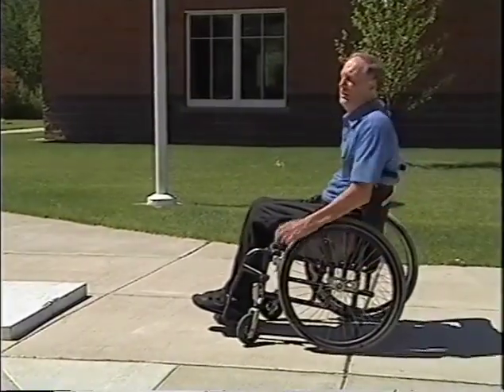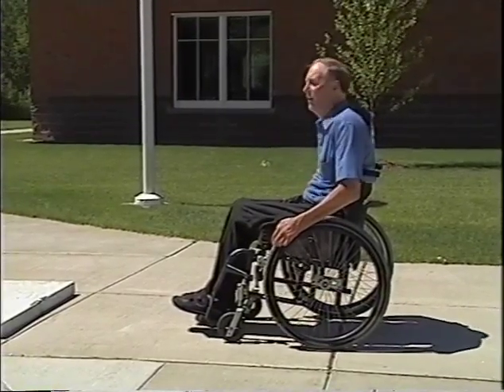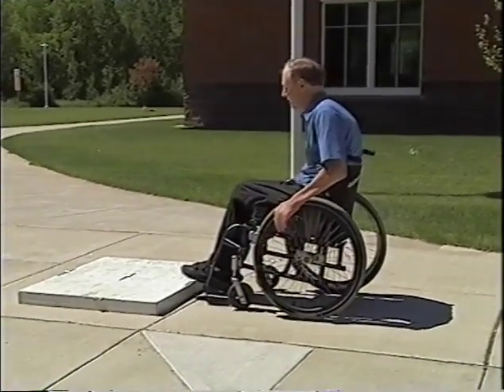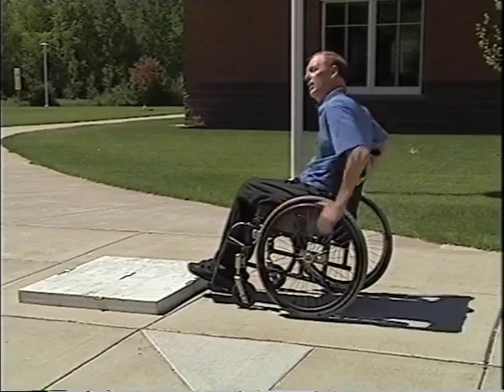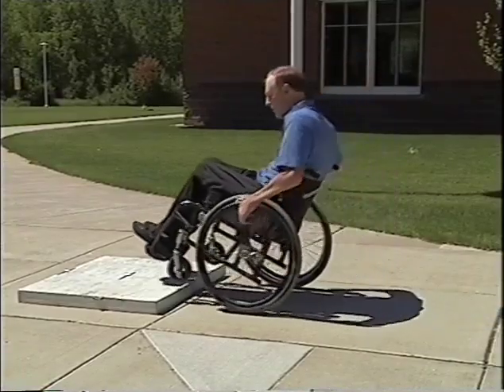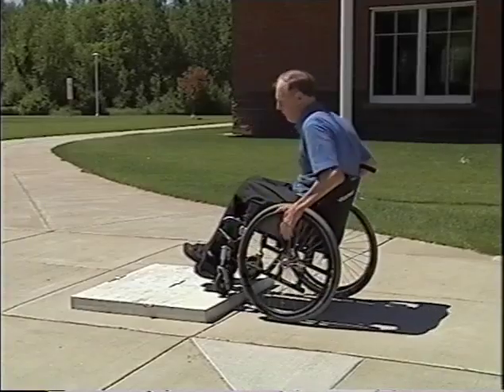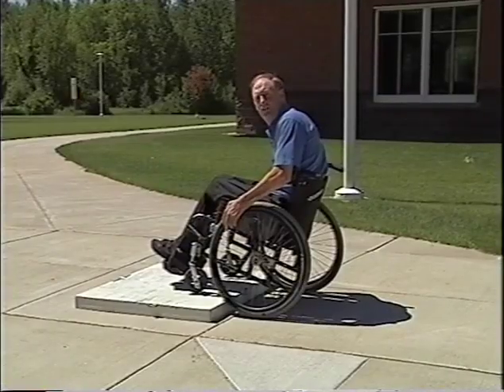So now that you've practiced jumping over the cracks in the sidewalk or lines in the linoleum, whatever it happens to be, the next step is to jump up the curb. And for that, you better roll up slowly. You see the curb between your toes. You can see my front end is only a few inches away from the curb. You're reaching way back to this giant stride, picking the chair up, and you want to land those wheels on top of the sidewalk before your back wheel hits. So you have a very small window of opportunity of about 8 inches before that wheel contacts the curb.